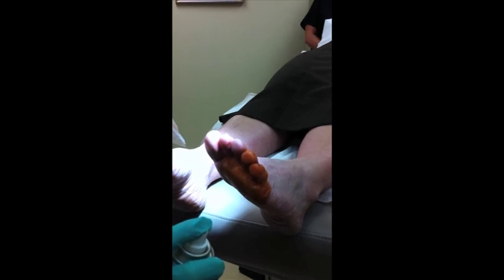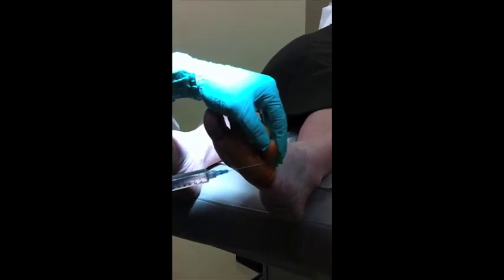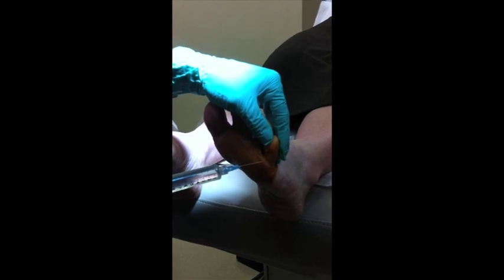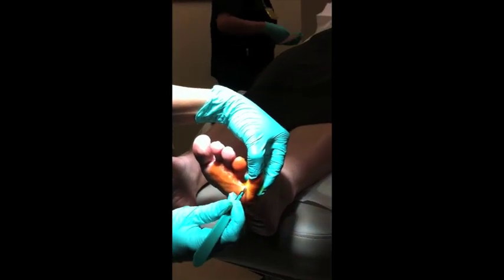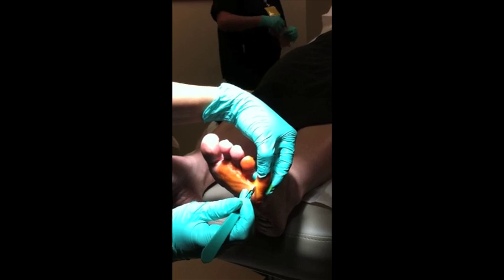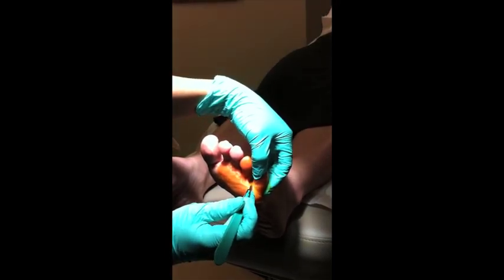We're going to numb the skin up with cold spray so that the needle doesn't hurt. And now we're ready to inject. What the patient will feel is a stick and a slight burn as the medication goes in. Now this toe is nice and numb. What we're going to do here is make a small incision in this plantar sulcus and through that incision we're going to tenotomize or cut the flexor tendon which is pulling the toe in a curled position.